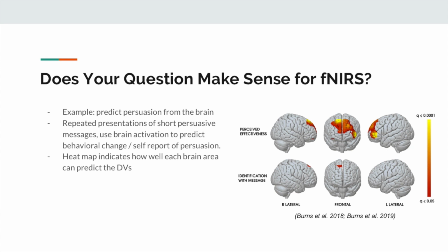But you can't align subject specific functional maps into some common space. That's what the digitizer kind of does. It aligns them all into this common space, this real space, the physical space that they were in when they were there. So that's what it's doing, it's aligning those people into the same space.